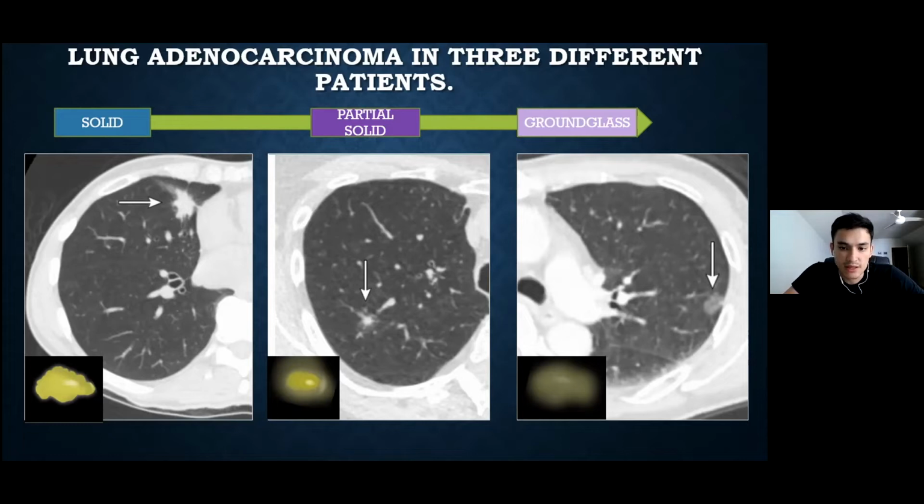And in the middle, there is a nodule with a solid component, a solid core, and underlying or surrounding increased density. That is a ground glass density. Ground glass density is higher than the pulmonary parenchyma, but it's not enough to obscure the bronchovascular markings.